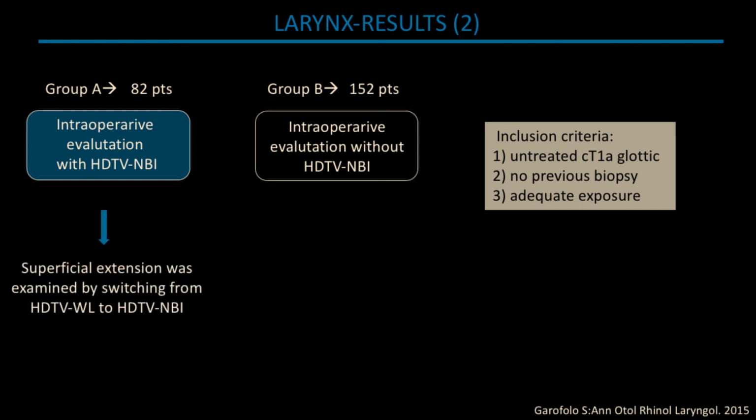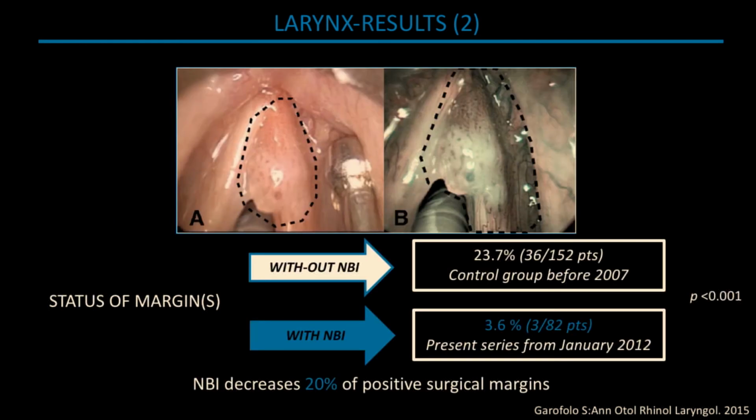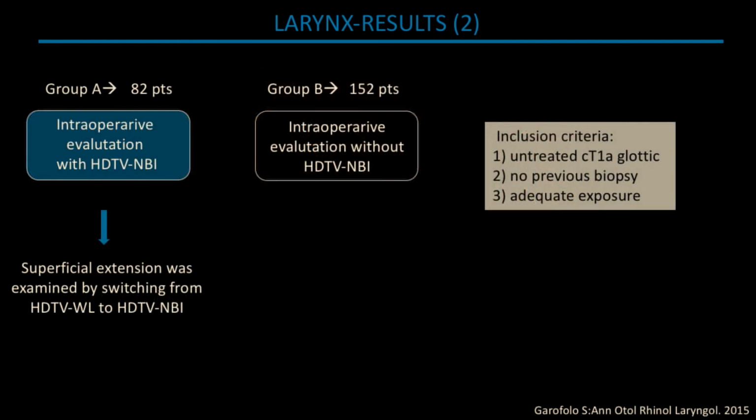the superficial extension was, of course, evaluated switching from high definition white light to high definition NBI.